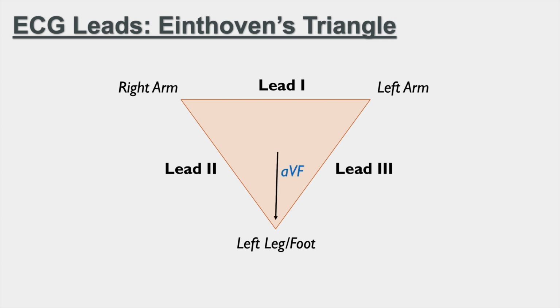With lead 3, we can also derive what we call augmented leads. And augmented leads include AVF. So F, you can remember, for foot. That lead points toward the foot, so the positive direction points toward the foot.